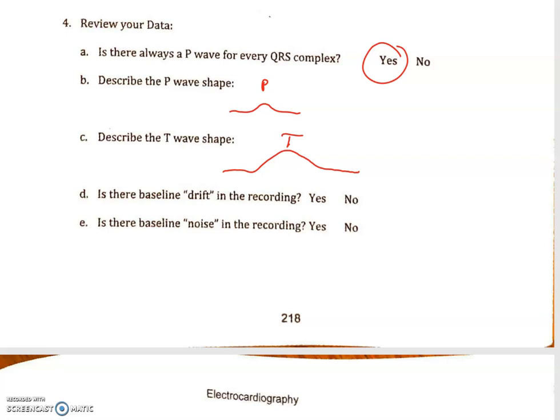Is there baseline drift in the recording? A lot of times we do have that, but we're doing imaginary data here, you didn't record anything, so hopefully there was no drift in the recording, meaning that the baseline would just go up like this or something like that. That's not good.